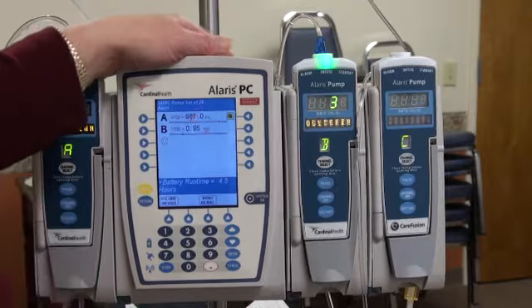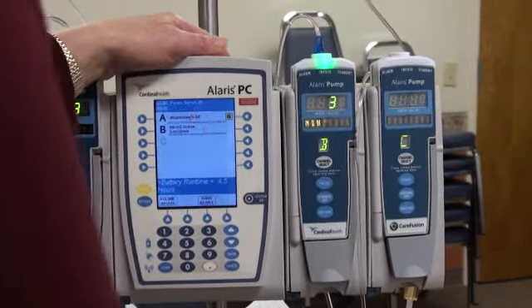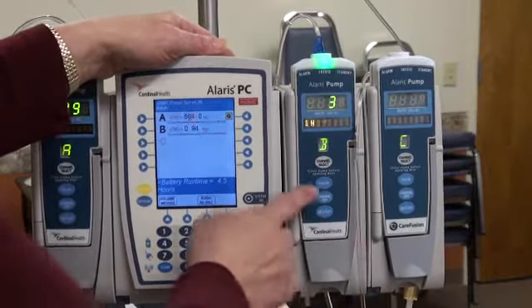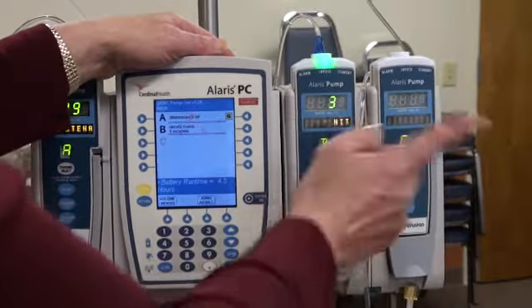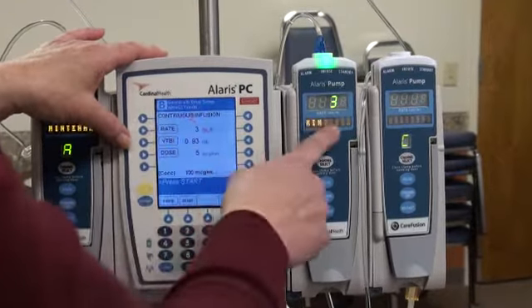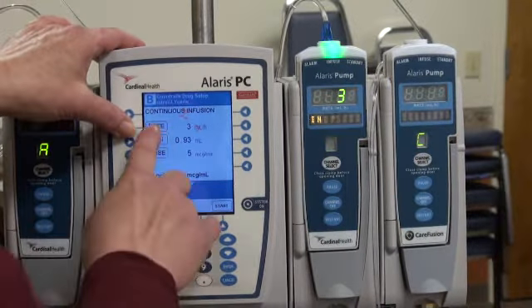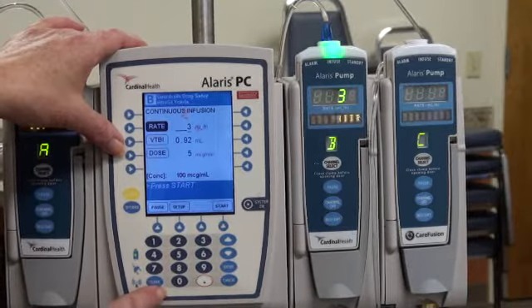You need to change the rate. The doctor gave you the order to titrate as needed. So you're going to need to change the rate of your nitro. You're going to hit channel select, and you know by reading the screen this is the nitro. So you're hitting your channel select. Channel B, you're right there. It's continuous infusion. You're going to hit your rate. You want to increase it to 10 mics.